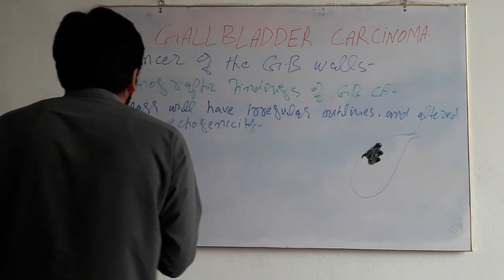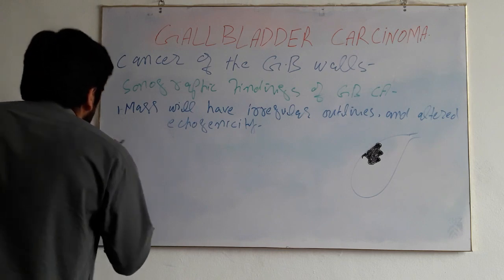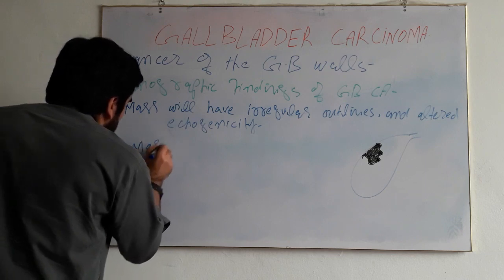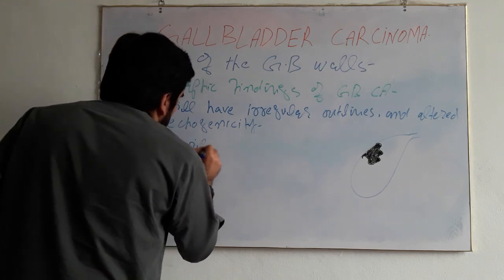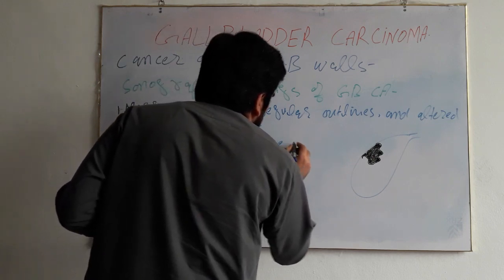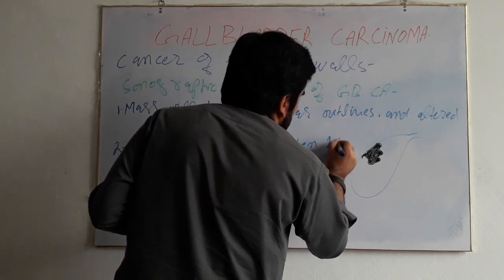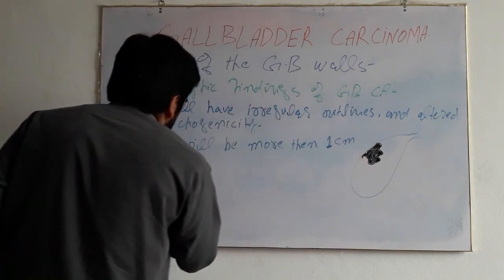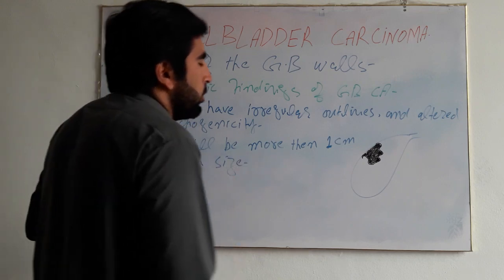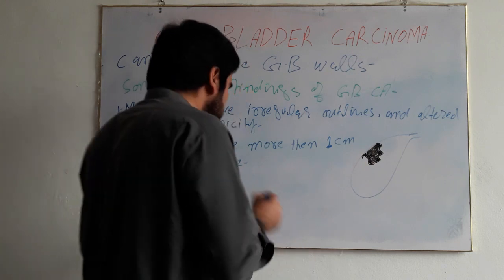Second, mass will be more than 1 centimeter in size. So if it is malignant, it will have more than 1 centimeter size.